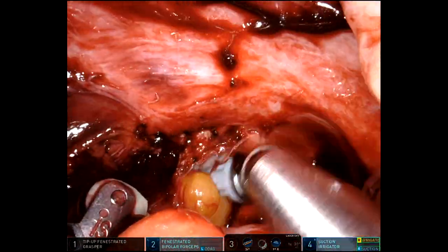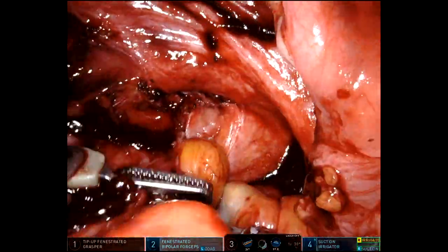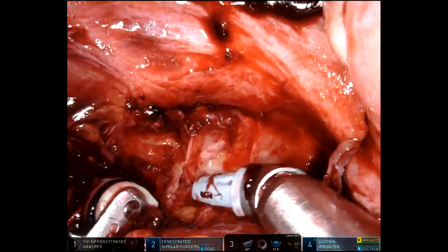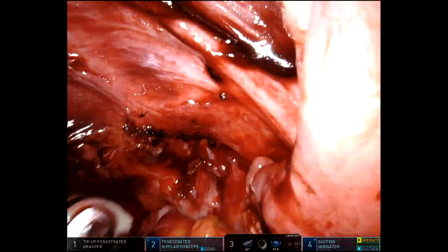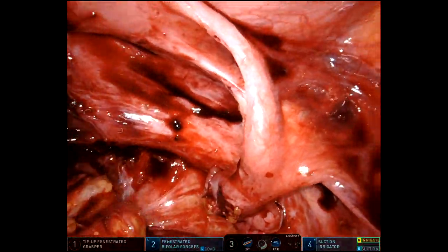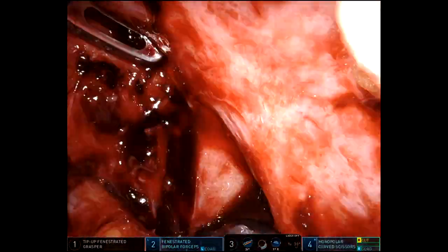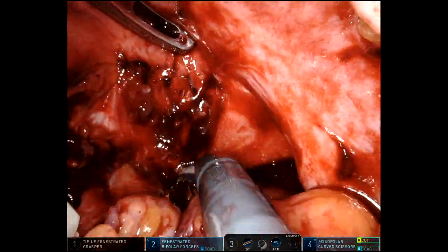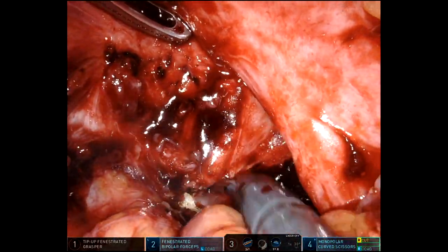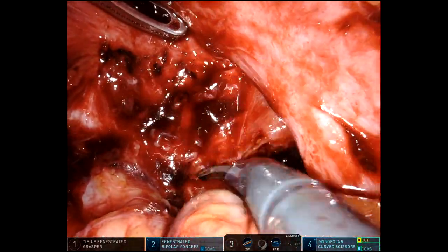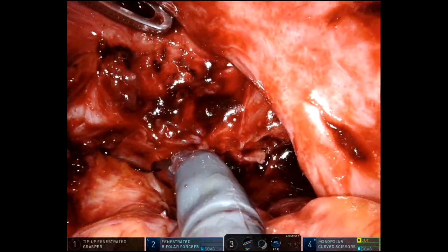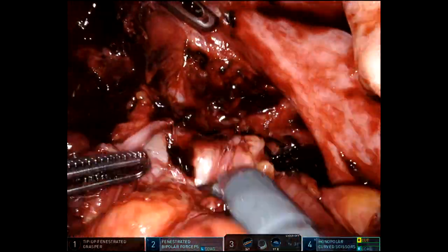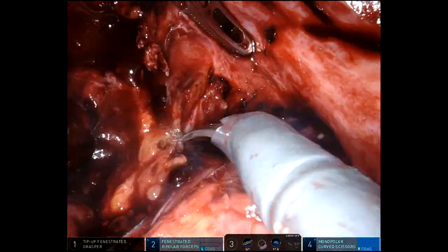Coming down deep in the pelvis, this is just the colon stuck to the anterior peritoneal reflection. She clearly had an abscess down deep in there causing some adherence. This is just separating that distal sigmoid loop from the peritoneal reflection. I don't think there was truly a fistula down here — I think it was just stuck from the abscess and the rind.